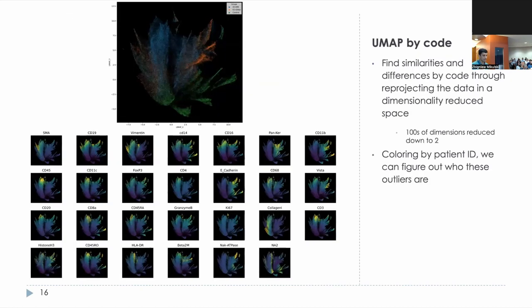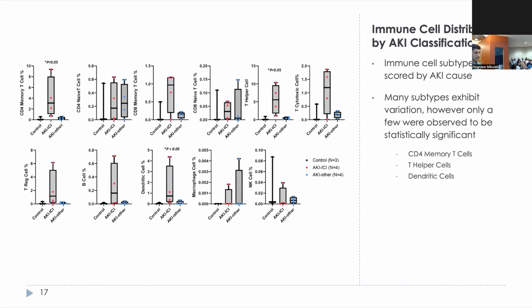As a means of visualizing heterogeneity, we can employ dimensionality reduction techniques such as UMAP to project all cells in our dataset into a reduced dimensionality space. Cells can be colored by categorical supplementary patient information such as the cause of AKI, or by marker intensity values. Tying this back to the original study, we scored our samples for a variety of immune cell subtypes, identifying those with differential scoring for one AKI classification relative to others. CD4 memory T cells, T helper cells, and dendritic cells were among those observed to be statistically significant.